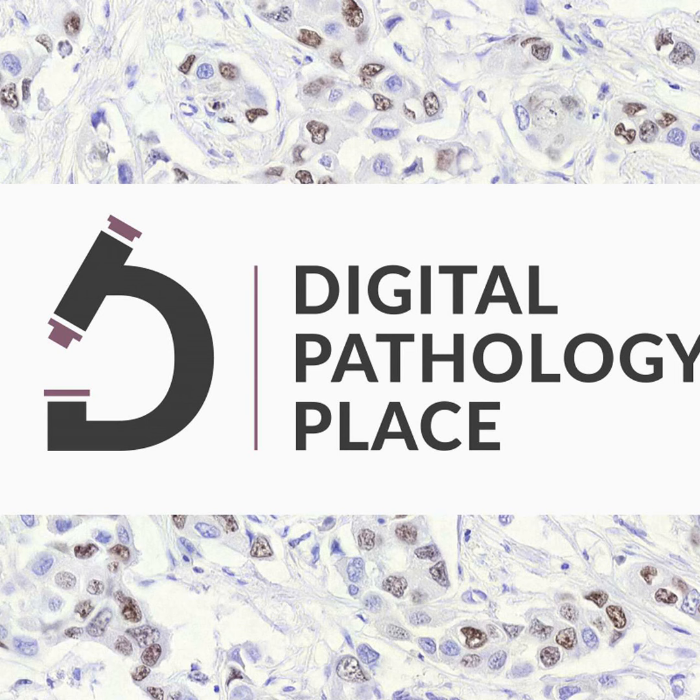They did the PSMA PET, they did computer tomography, and they used either the gallium marker for 20 patients, or the fluoride for 15 patients. And then they did the radical prostatectomy. So they had the whole prostate, and they could do all the IHC they wanted. In addition, they did ex vivo CT, and then histopathological sections were prepared. Then they manually defined areas with different morphologies, and they defined an H-score of IHC PSMA.